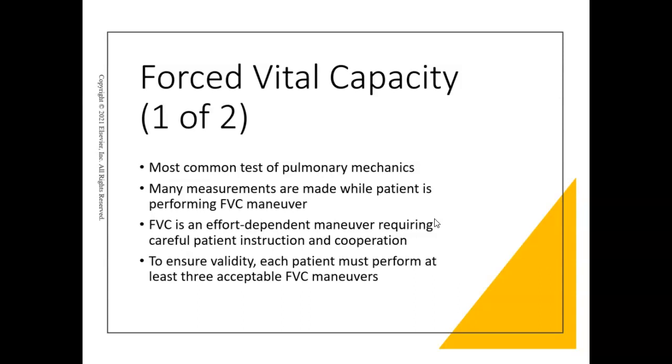When you're observing the patient, I always use the term suboptimal effort for patients who aren't cooperating with me. I can coach them through it and explain what I'm looking for, and most of the time that works.